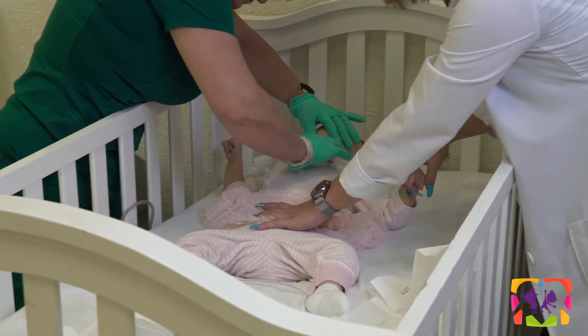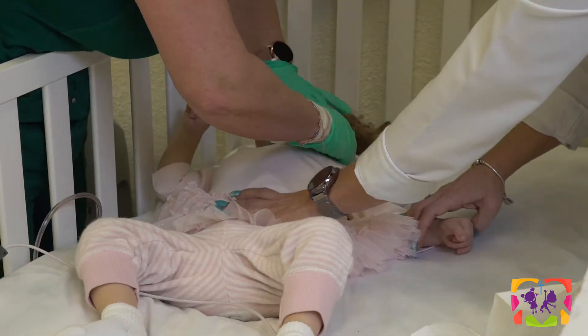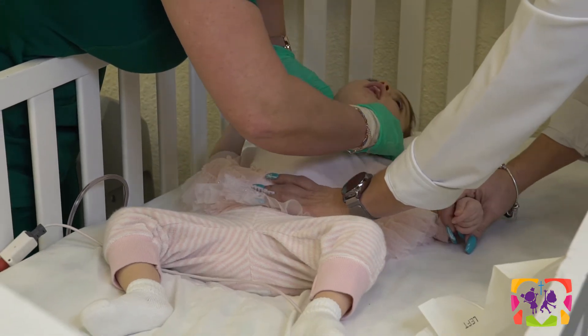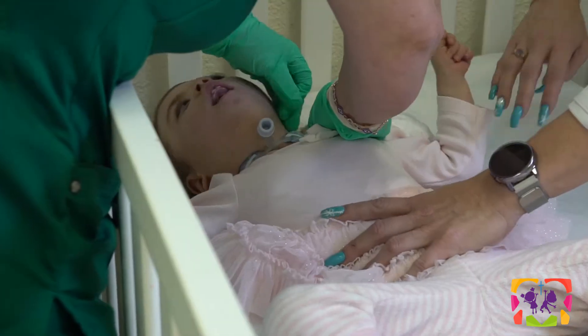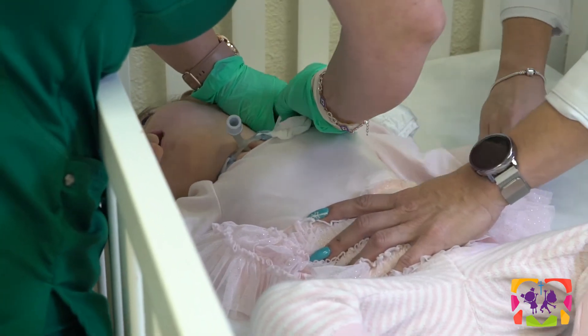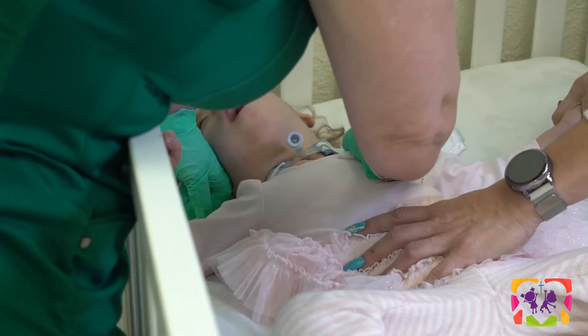Then you want to pat dry the area as much as possible. Now we're going to change the trach collar. You always want to release one side first, then attach the new one on that side before removing the entire trach collar.